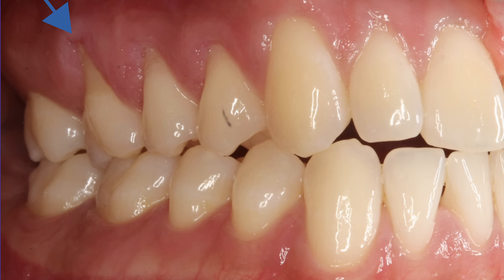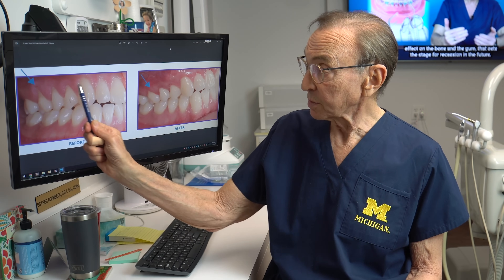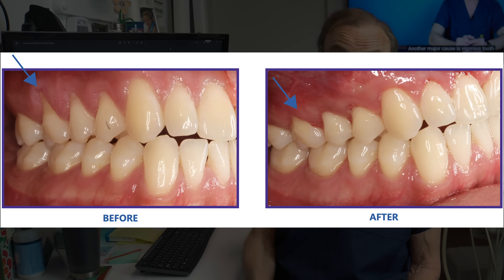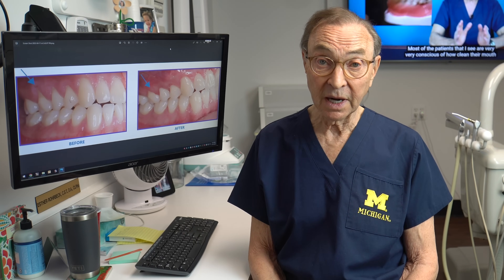Here's another case. The upper right area here — you can see this gum recession — and this was before. We treated it, brought that tissue down: less sensitivity, better cosmetics, better life expectancy for the tooth. It's just healthier, everybody's happier — win-win situation.